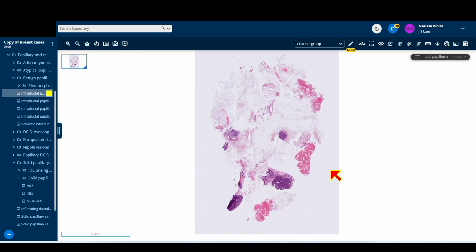So I have a hodgepodge of scanned virtual slides. I have papillary lesions and then a few examples of the triple negatives that we talked about. I get the sense that the papillary lesions would probably be the highest yield to go through first. So we'll do that and then wrap up with the triple negative lesions and some salivary gland type breast cancers. And we'll try to keep this to around 50 minutes. Does that sound good? Okay, cool. So let's start from the very beginning, papillary lesions.